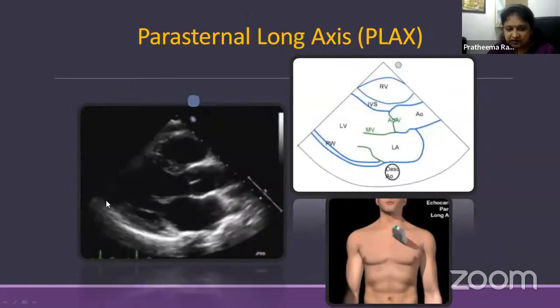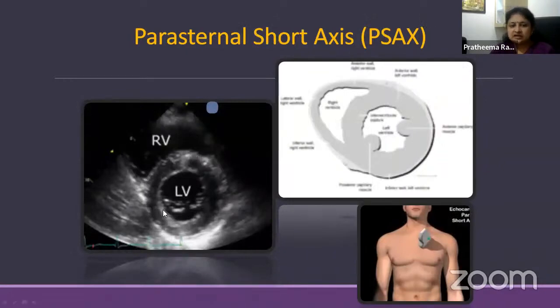So this gives us the ejection fraction. We can see how much LVOT we can measure. We can measure how much of a velocity time integral. These are all fancy terms, but it is basically to calculate the cardiac output. So we all know that the left ventricle will contract to eject blood through this. So if we measure the velocity and how much the aortic valve is opening and how much blood is ejected through the aorta, we can find out the cardiac output. It is literally in proper English, only that we are measuring in this view. And we can see the contractility.